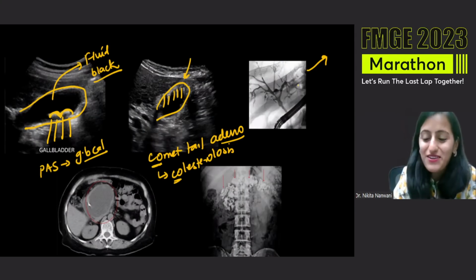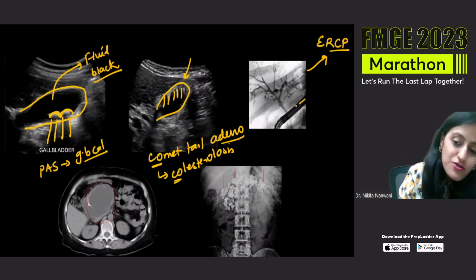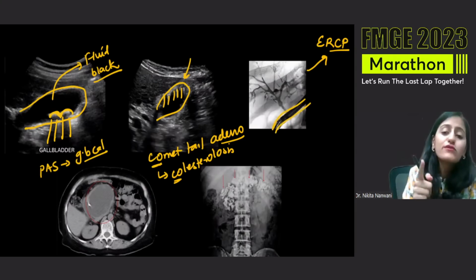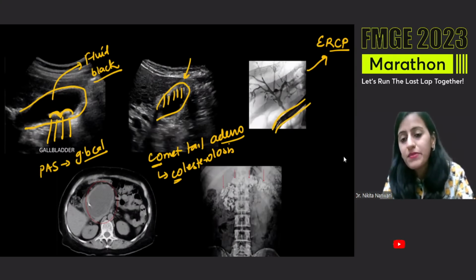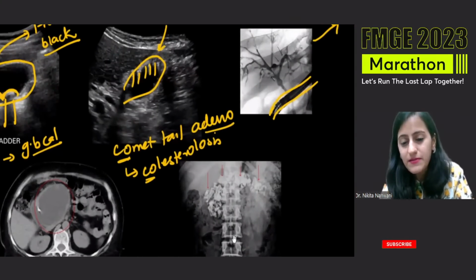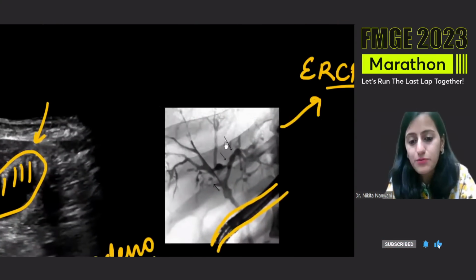Very good. Correct. Vikram, absolutely right. That is ERCP. Yes, Dr. Shabir Rishabh. ERCP, you can see that here the endoscope is appearing black because it's a fluoroscopy image. It can be black, it can be white. And in this ERCP, what do you think is the diagnosis? Let me zoom this image for you so that you can see it.